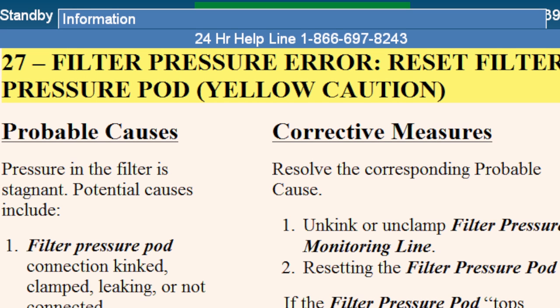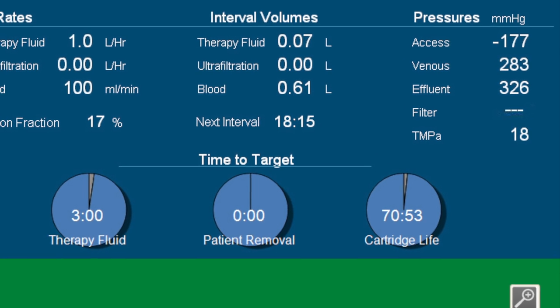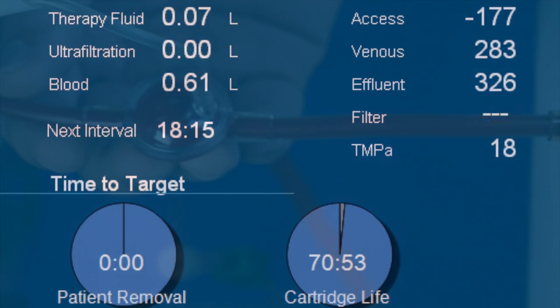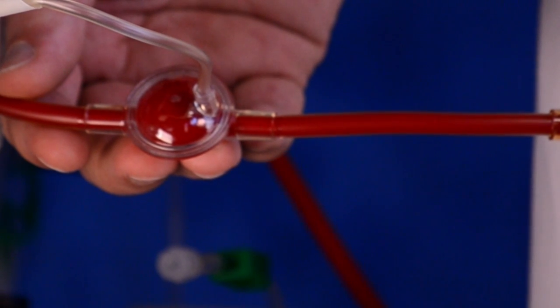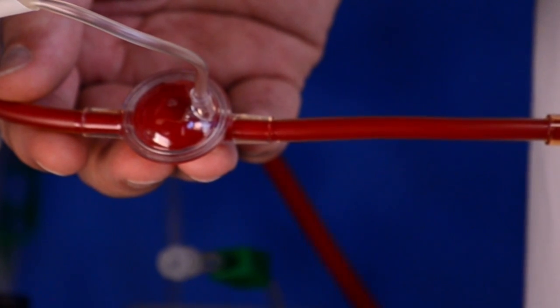Filter pressure pod. Occasionally you may be required to reset the filter pressure pod. You may be prompted to do this if the machine gives you a number 27 yellow caution: Filter Pressure Error, Reset Filter Pressure Pod. This action may also be indicated if the machine is no longer displaying a filter pressure, if the filter pressure pod is no longer pulsing, or if there is little to no fluctuation of the filter pressure over time.